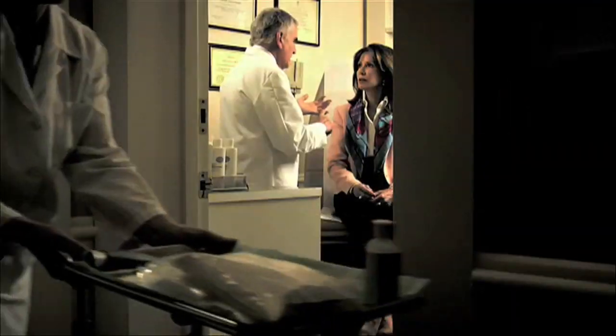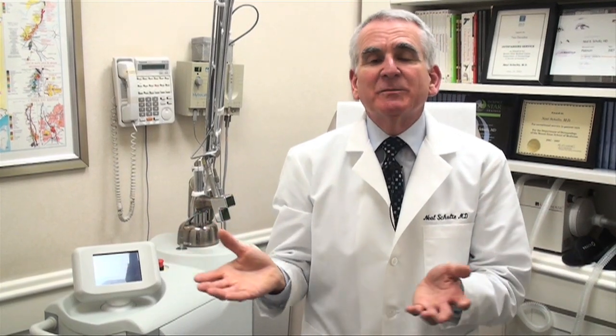Hello, I'm Dr. Neal Schultz, and welcome to DermTV. In so many of the DermTV segments, we speak about laser treatments, either for broken capillaries on the face, or to remove tattoos, liver spots, brown spots, and even for permanent hair removal. I just thought it was time for me to show you some of these lasers so you could see what they're like.